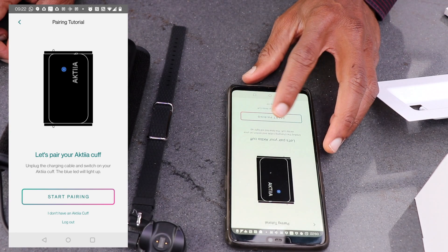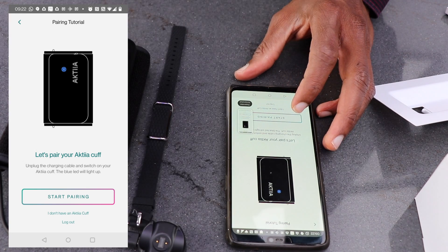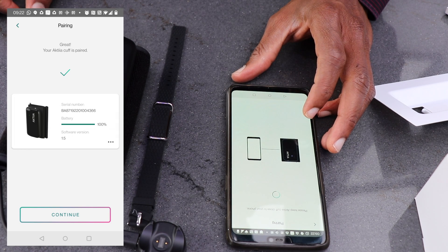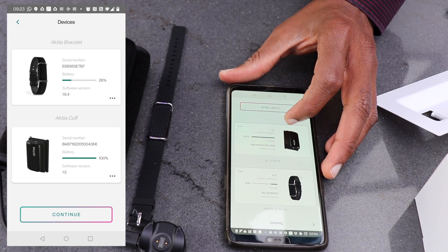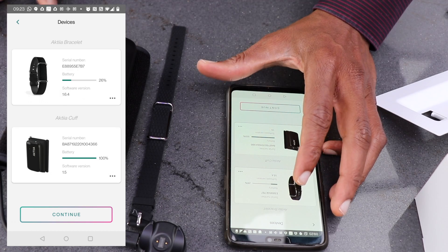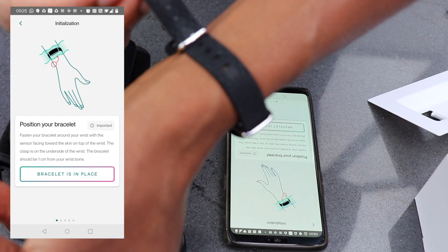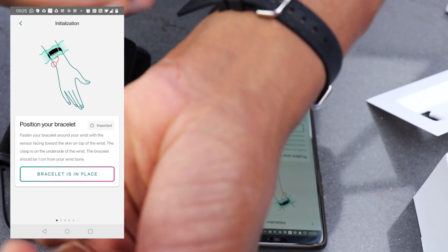Now you need to pair the wristband with the blood pressure cuff. The wristband is now successfully paired with the blood pressure cuff. Once that is paired you then put on the wristband — make sure that it's a snug fit.